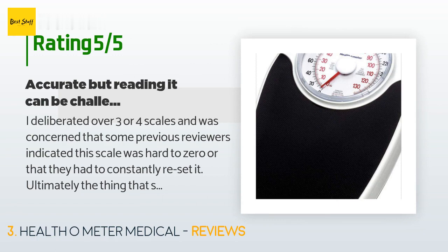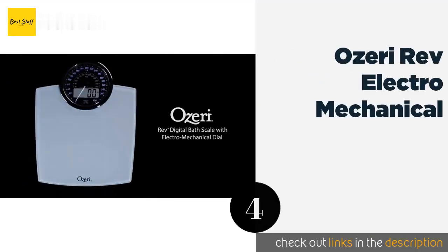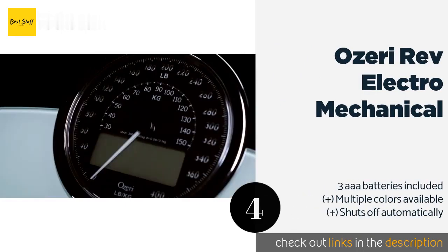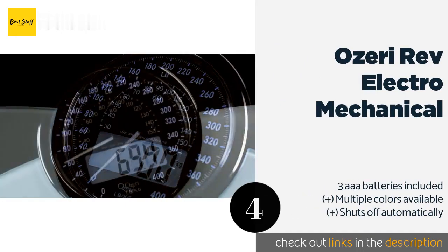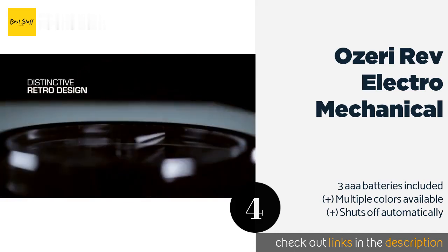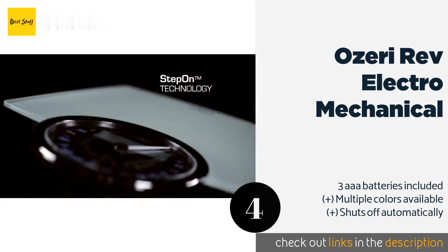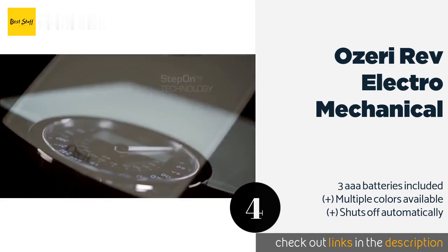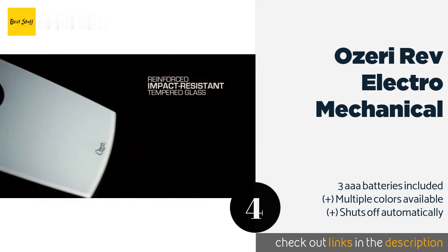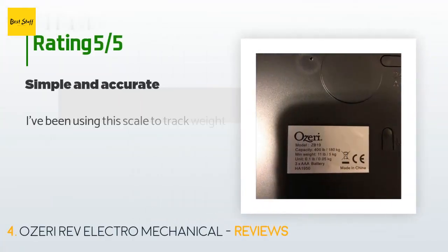The next product is the Ozeri Rev Electromechanical. Strictly speaking, the Ozeri Rev Electromechanical will not measure your weight without batteries, but it does have a large dial which makes it a popular choice with those who enjoy a blend of new and traditional technologies. The price is around $27 — check out the product link in the YouTube description below. The average rating is 4.5 stars with more than 3,875 customer reviews.